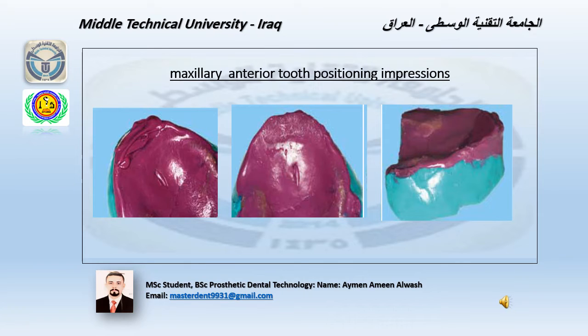arrangement of the artificial teeth away from this area to avoid interference during pronunciation, and it gives us the neutral zone anteriorly for setting the artificial teeth.